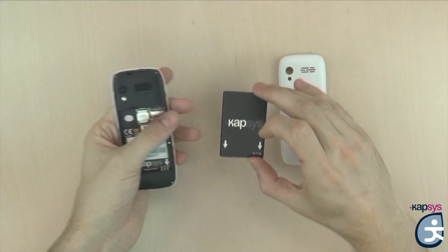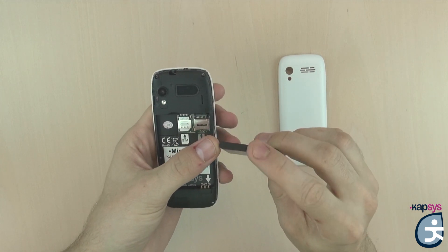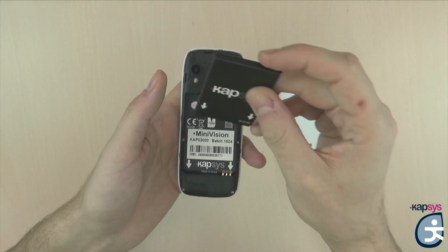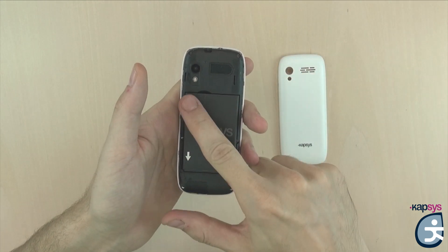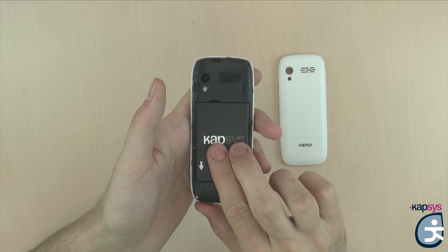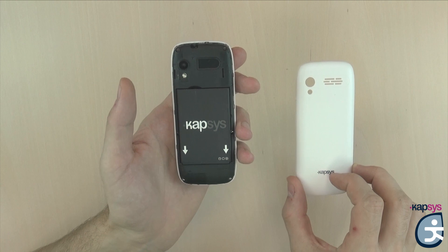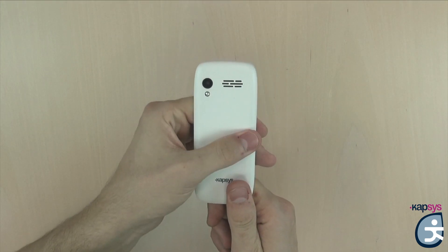We will now insert the battery into the phone. We will locate the metal connectors of the battery, which are situated at the bottom right, and place them at the bottom right in the phone. Insert the bottom of the battery first and then the top. There are foolproof plastic pins that avoid putting the battery in the wrong way, so just do not force — put it gently and when the four corners are inside, the battery is well positioned. Then put back the cover and snap all the corners to close the Minivision.